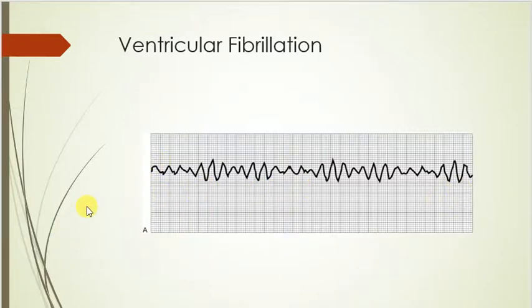Now, I've had patients pull themselves off the monitor and it looked like that. I ran to the room, all out of breath, but thank God they're okay. This is a pulseless rhythm. If they're in true VFib, there is nothing going on but ventricular fibrillation, so that makes sense that they would have no pulse.